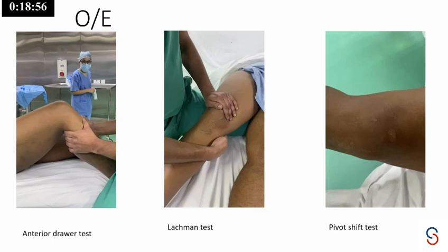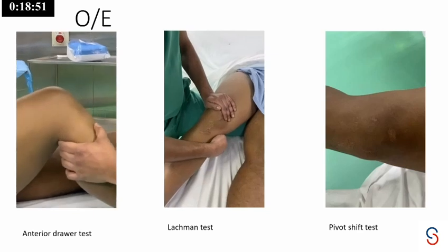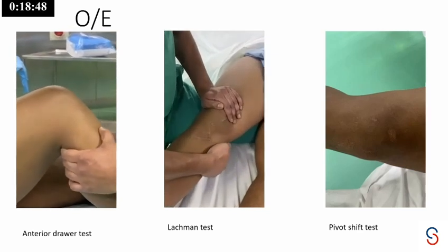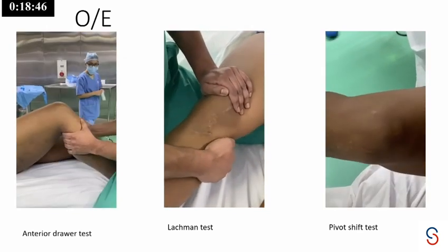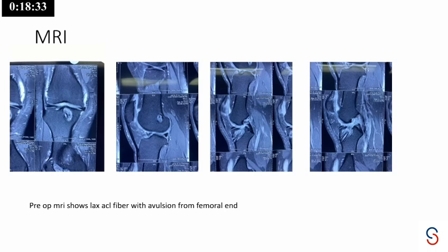On examination, anterior drawer grade 3, Lachman, and a grade 2 pivot shift test. We get an X-ray. X-ray looks as expected, medial compartment OA, and you can also see a little largish tunnel here. We investigate further and get an MRI scan: ACL graft ruptured at the femoral attachment site. What's also worthwhile noting here is this huge tunnel dimension of his tibial component.